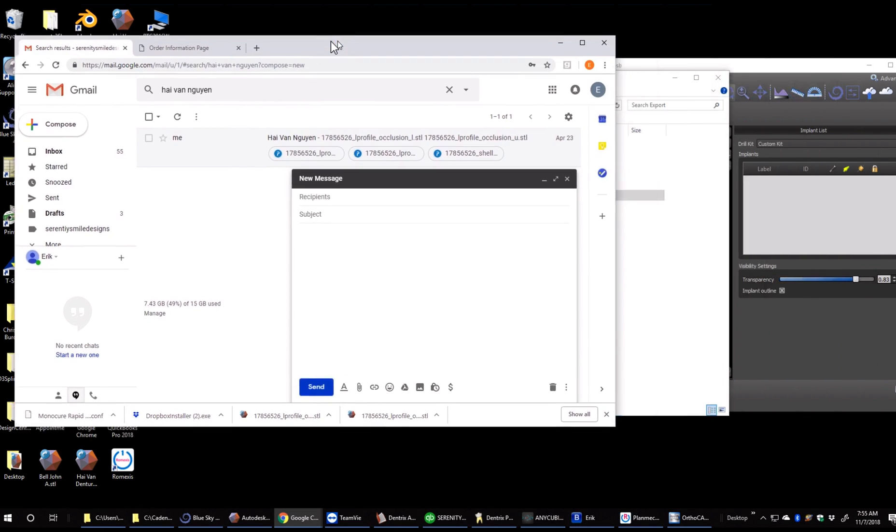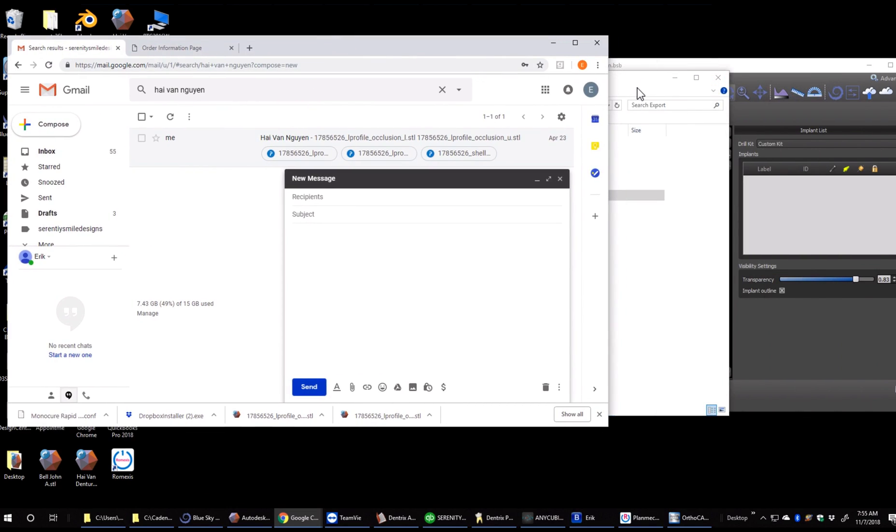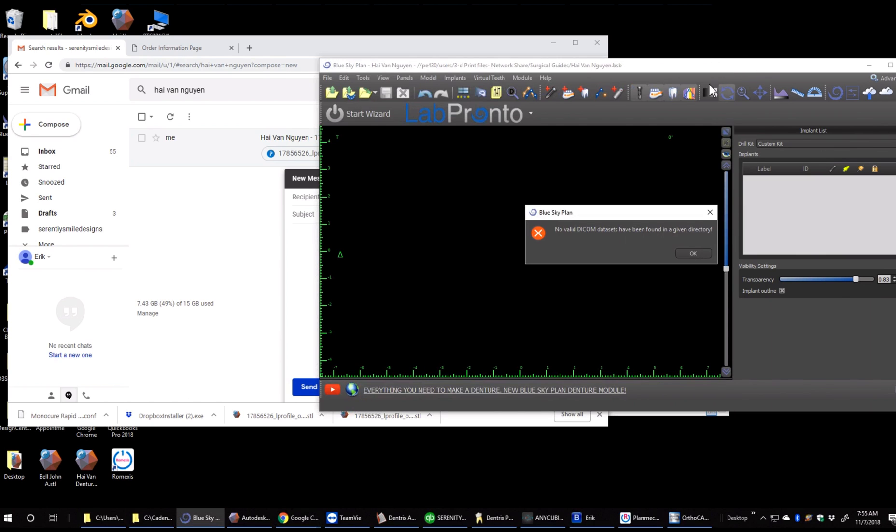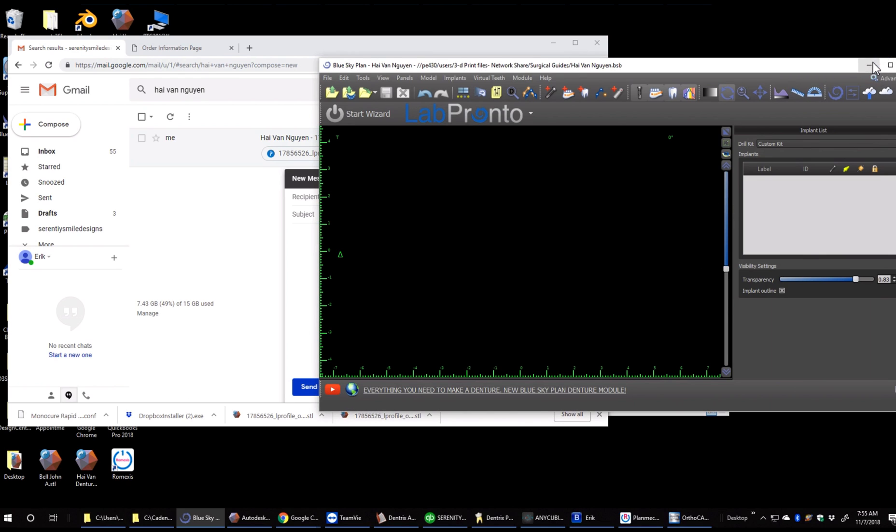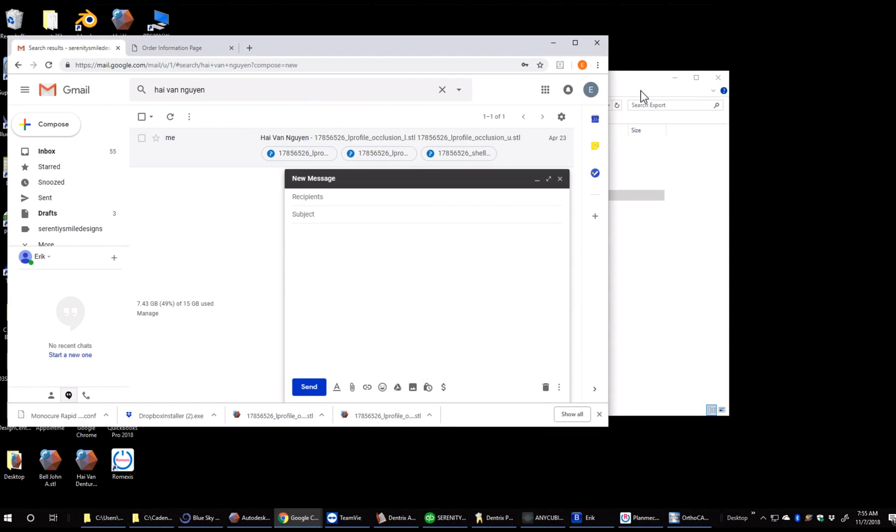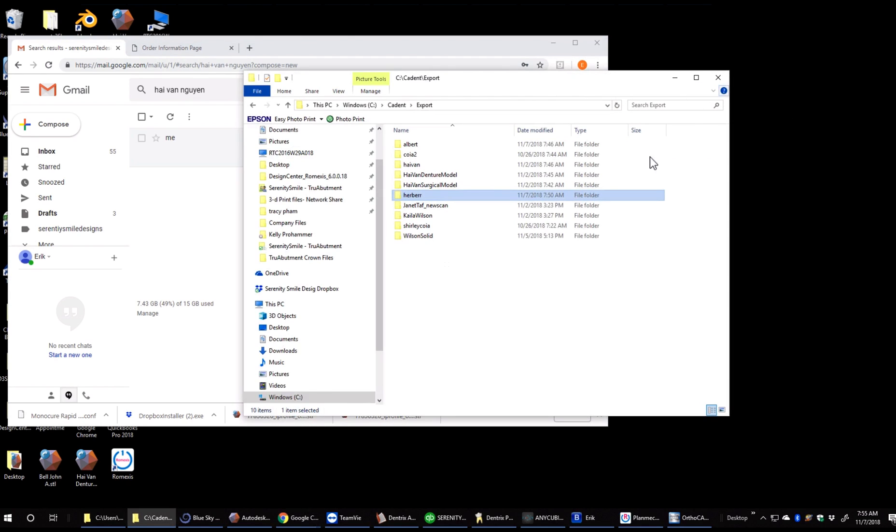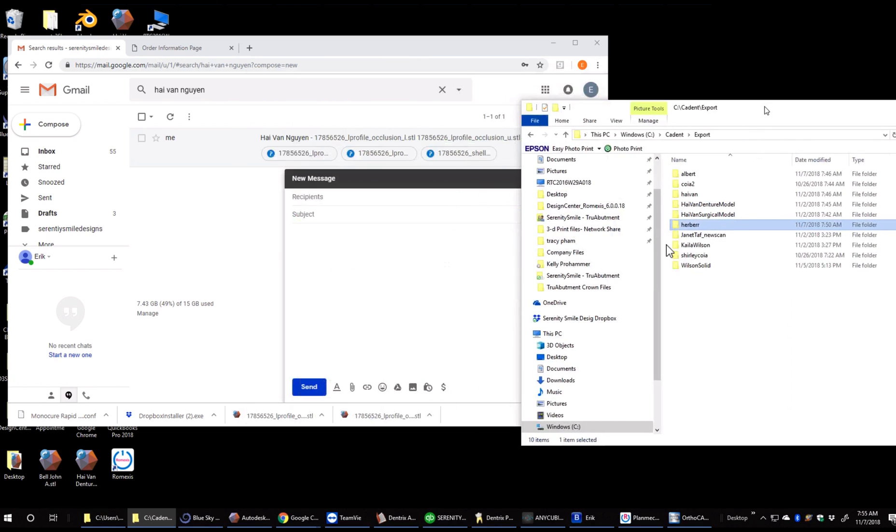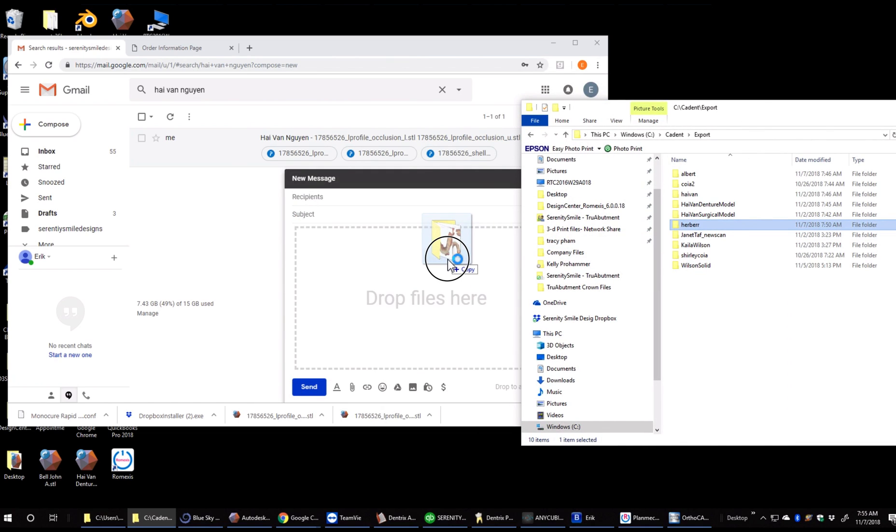Once we're in compose, we can take that file and drag that right into the email. You can see here we go.